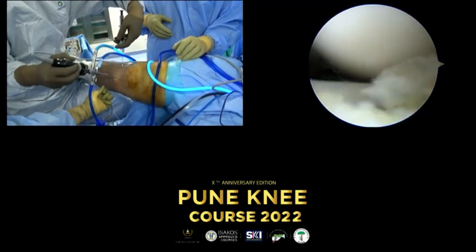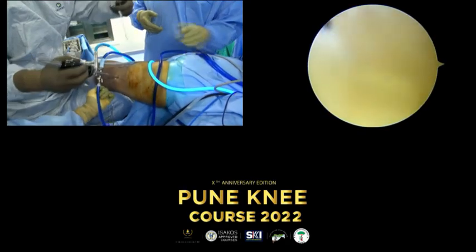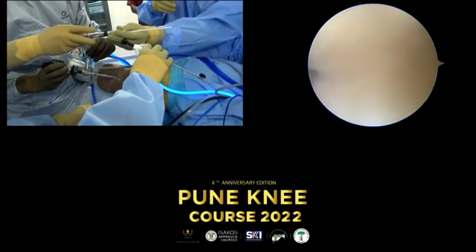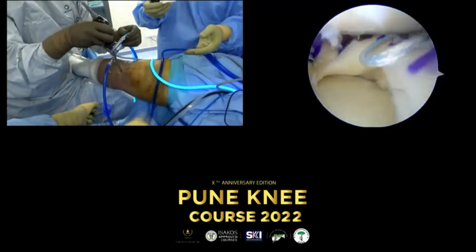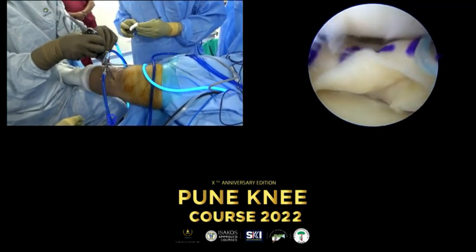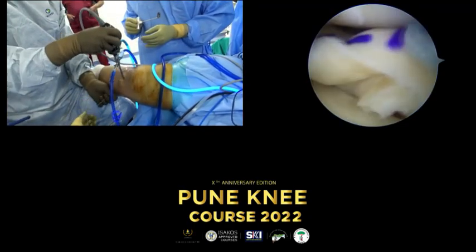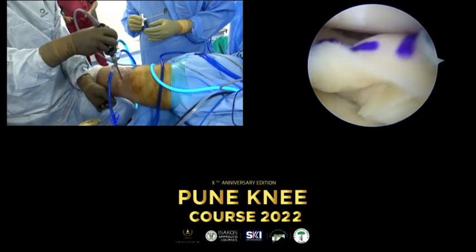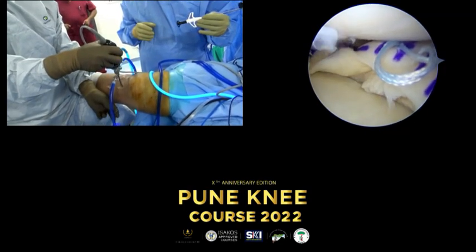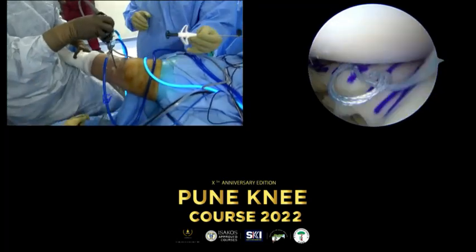Good. Oops. There we are. Again, with the scope, I try to put it a little bit above. I don't like it. You see, it is too proximal. I don't like it much. Let me see when I put it back in. I don't like it. I will take it out.